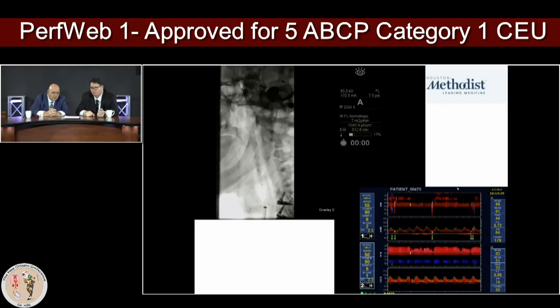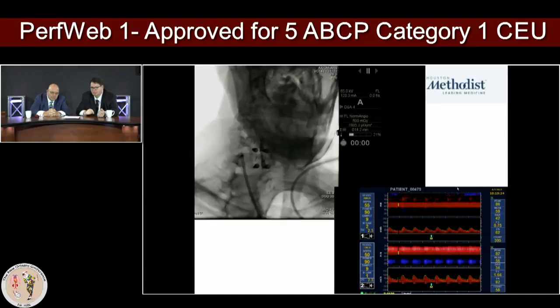Here, give it a second. Let it catch up. I think sometimes if you keep clicking it, can you advance it on my? There it goes. Yeah, so you see the flow improvement after the balloon.